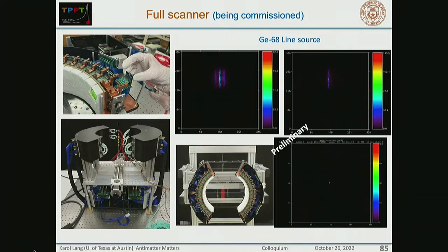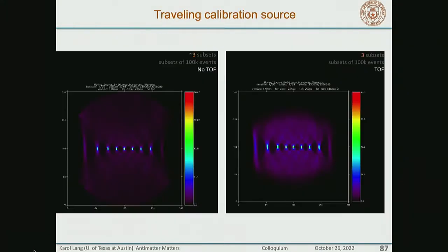This image is shown here in 2 views, and from the top. If you look from the top, you perhaps can see this dot. As you can perhaps see, it is mounted on a stage that can move. We moved it for about half an hour, and then took slices at times and reconstructed where the source was as it was moving.